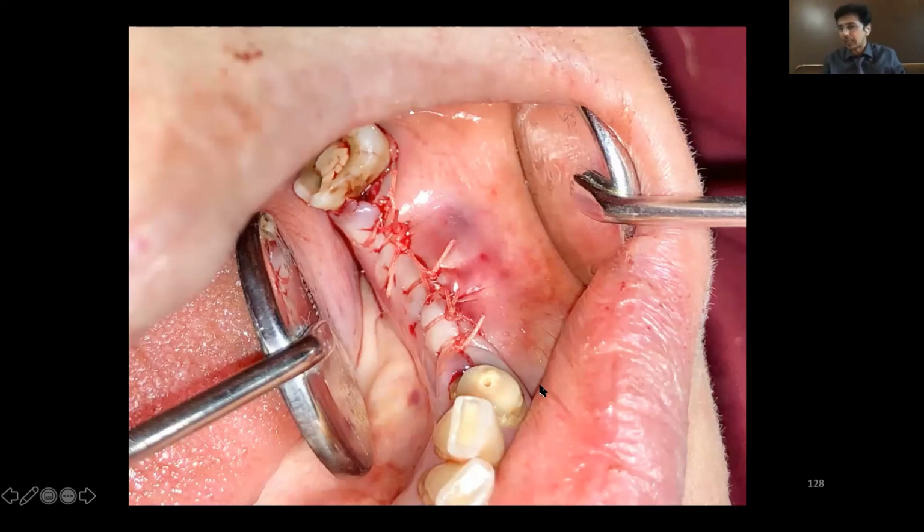I cannot even give a vertical incision. Otherwise, chances of paresthesia, etc. will increase. But the important thing is primary closure. So, for membrane placement in GBR, use it wherever you feel retention of the bone graft would be an issue. Do not keep this thing in mind that bone graft coming in contact with the flap would be an issue as such. So this is one thing which you remember.